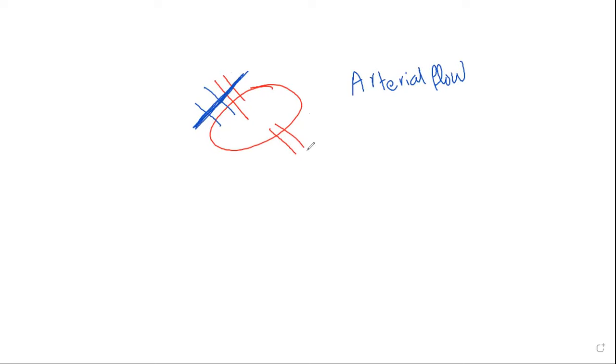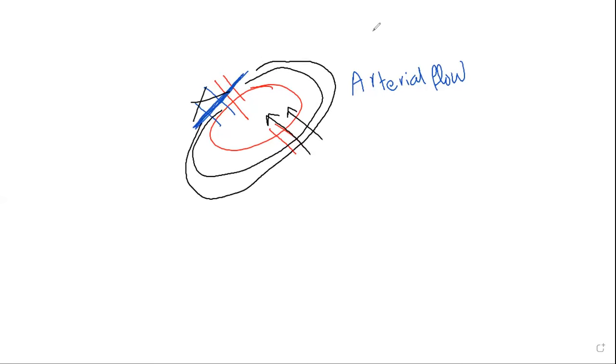So it's still present. And as there's still some arterial flow going to the ovary, but there is no venous drainage, this ovary will start to enlarge. So in case of torsion, what will I see? I would see an increased size ovary.